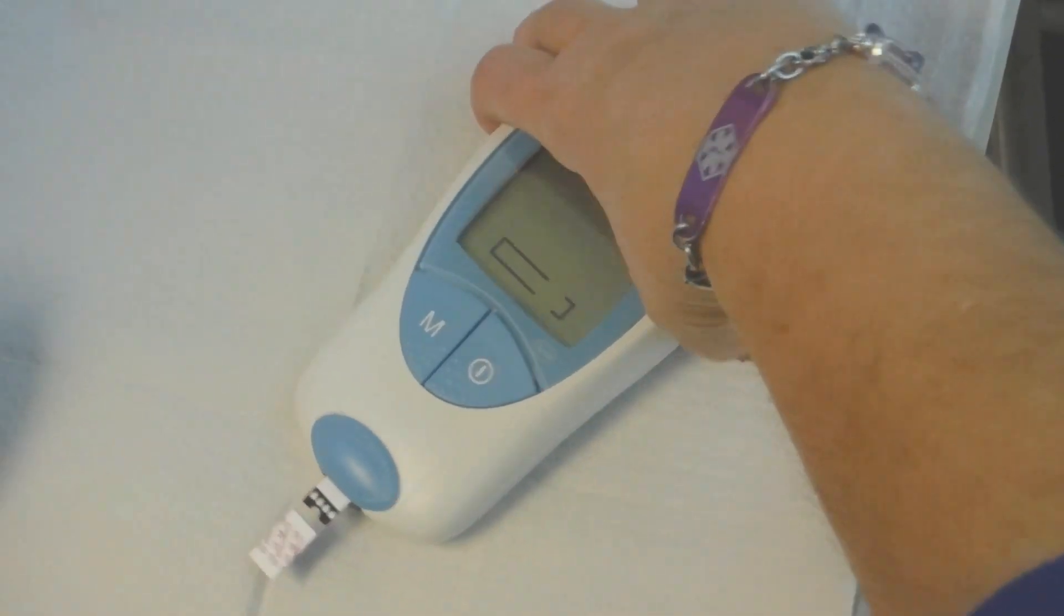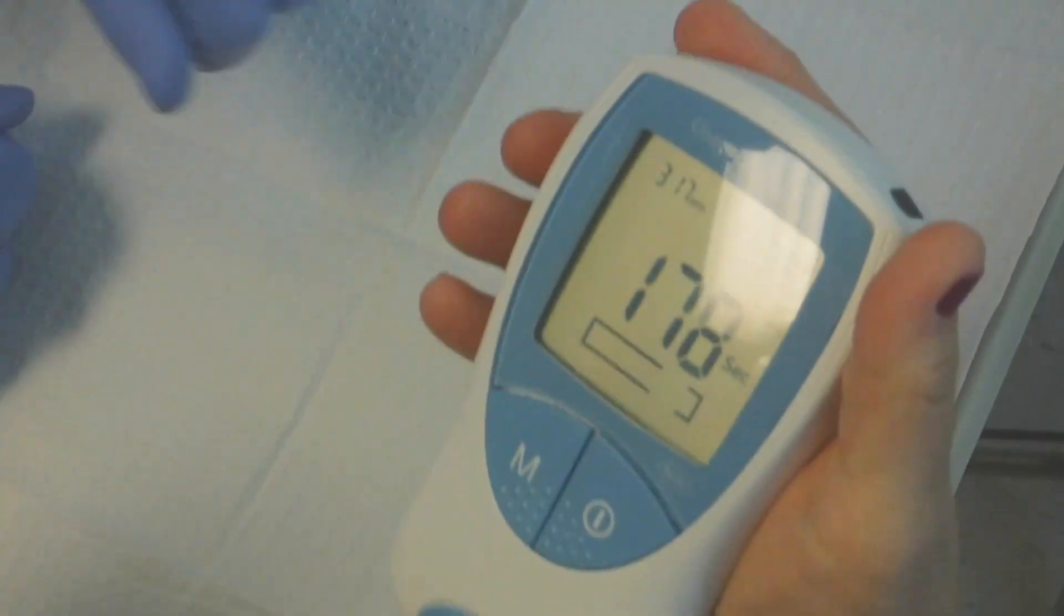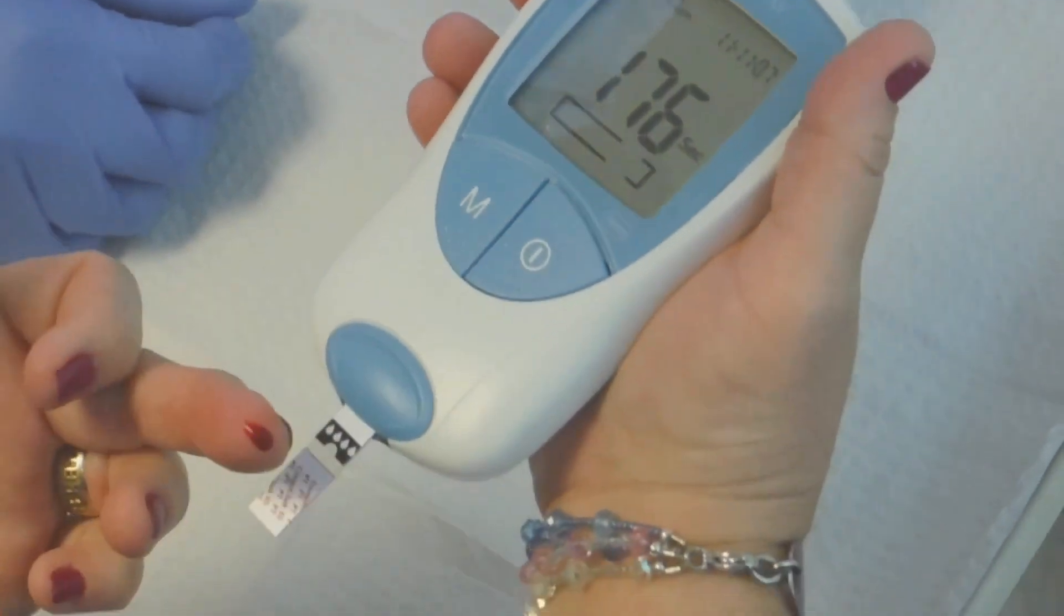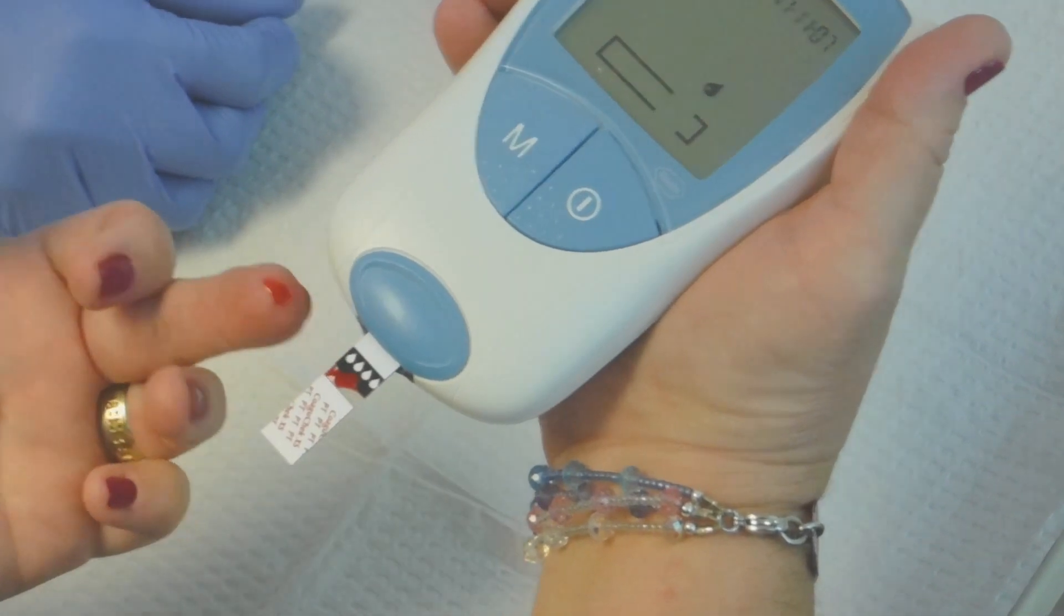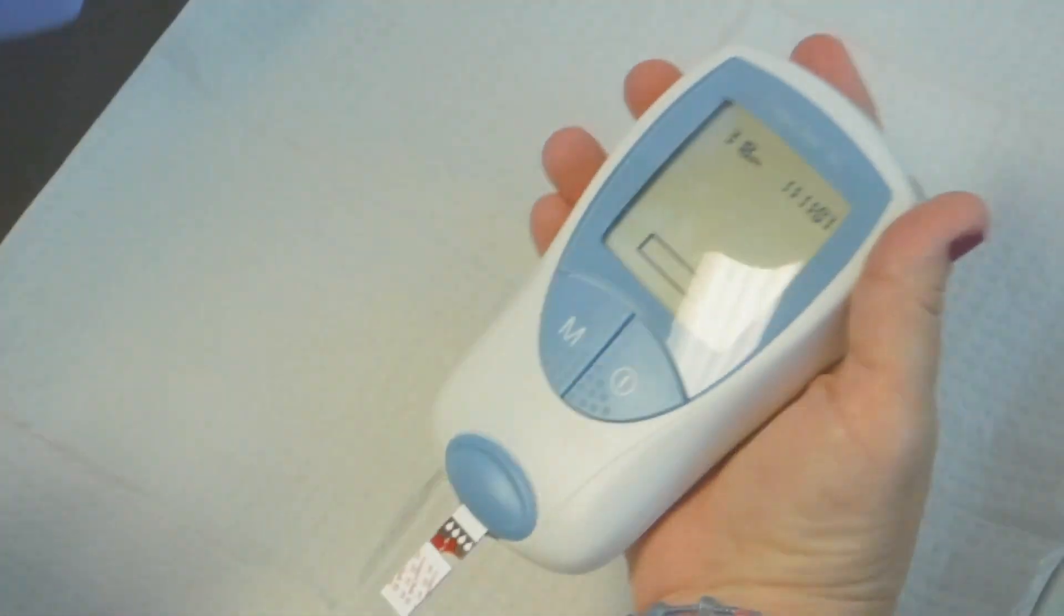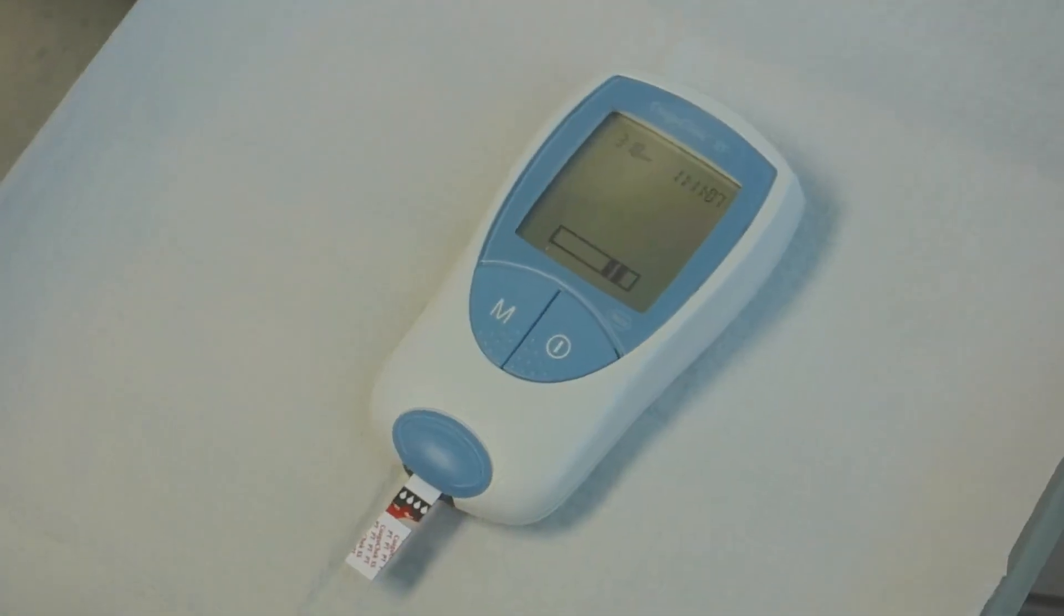So while it's blinking, I get to do it? Nope, not yet. Oh gotcha, see now it's the counter. And it's just for that middle. Correct, there you go. And that's it? You had enough there. Good, cool. Thank you so much.